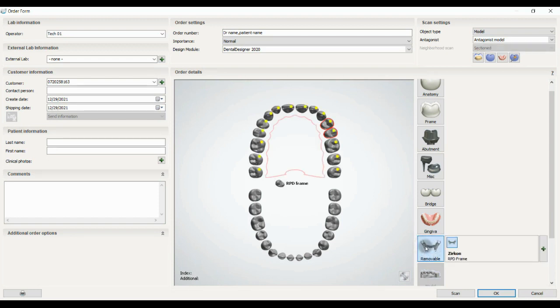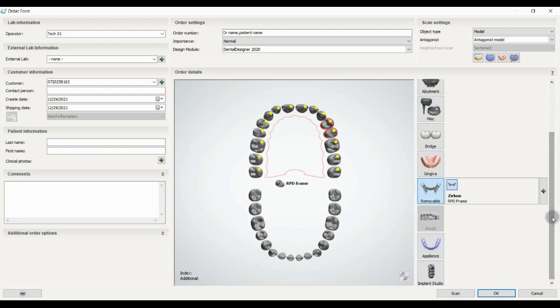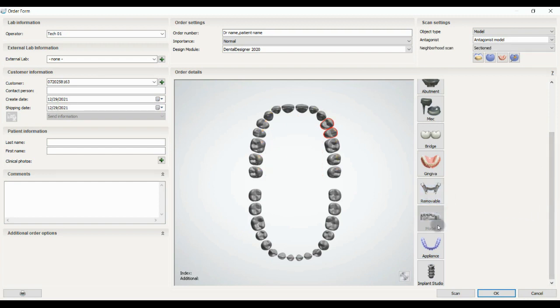The next one is for designing RPD frames. Next option that is not available in here is model, where you can create the model with this part. Also you can use appliance design in this software.